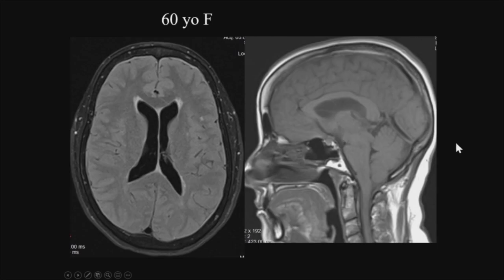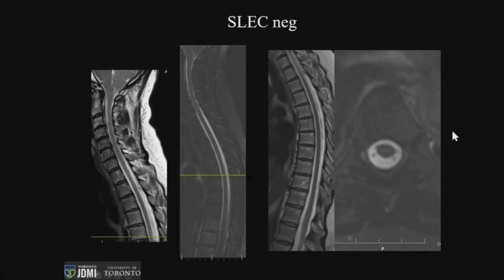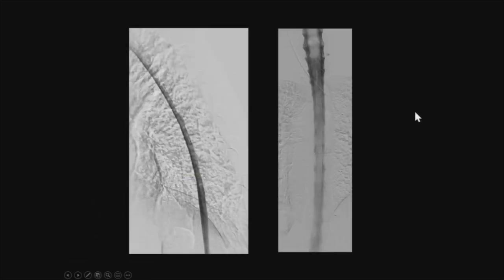Moving on to another type of patient — one who is brain positive with subdural thickening and brain sag, but SLEC negative. This was a woman I saw shortly after coming down here to Cedars-Sinai and learning how to do general anesthetic, biplane, digital subtraction myelography. The study was negative — there was a small diverticulum, nice technique, and negative.